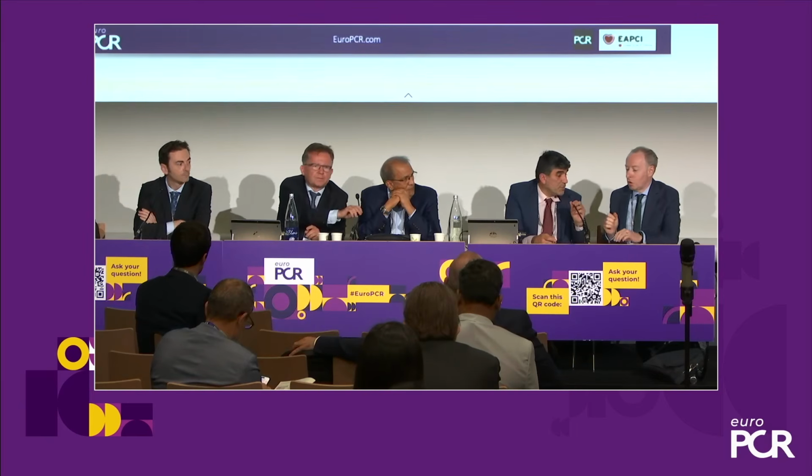And what is mandatory, what Curiti said before about thrombi, in laser catheter angioplasty, IVUS is mandatory, because we check what happened with the laser, what the laser did inside of a vessel, and calculate very carefully the real diameter of the vessel. Thank you. Peter, any comments?